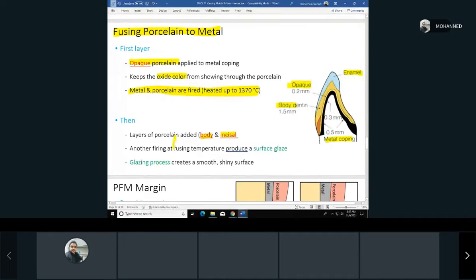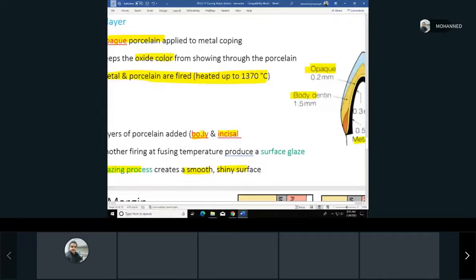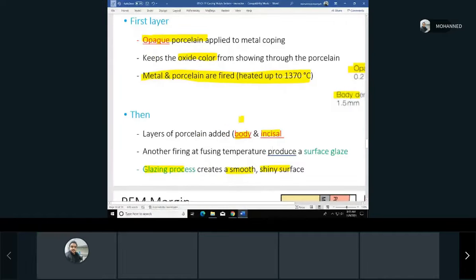And then the second and third layers will be the body and the incisal, and then they will fire it up. The last firing that we make we call the glazing firing, which gives the glazing factor of the crown, and technically it will make a smooth, shiny surface. That's the glazing process, which is the last heating up. Again, we saw that in the video. They put it in the oven, they fire it up, and it comes out looking exactly like a normal tooth, with all the shininess and smoothness of the tooth. All good? Yes?